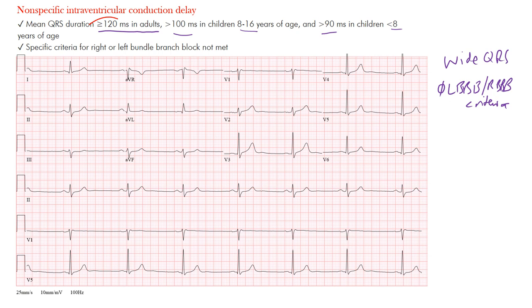The focus here is on adult patients, so over 120 milliseconds. Looking at the QRS complex — from the P wave through the QRS to the T wave — the duration is measured from the beginning to the end of the QRS complex. Normally in adults it should be less than 120 milliseconds, but once it reaches or exceeds that point, we call it an intraventricular conduction delay, and you have to determine what type.